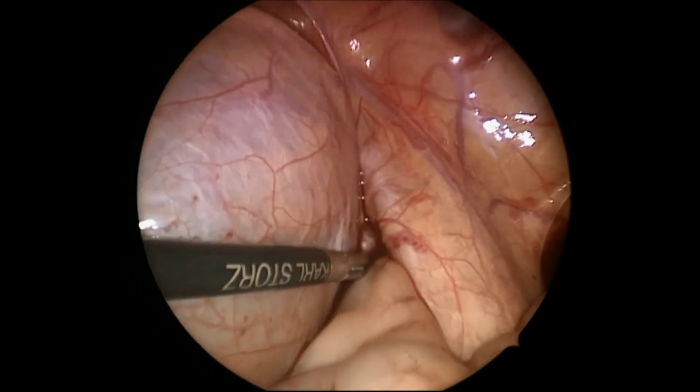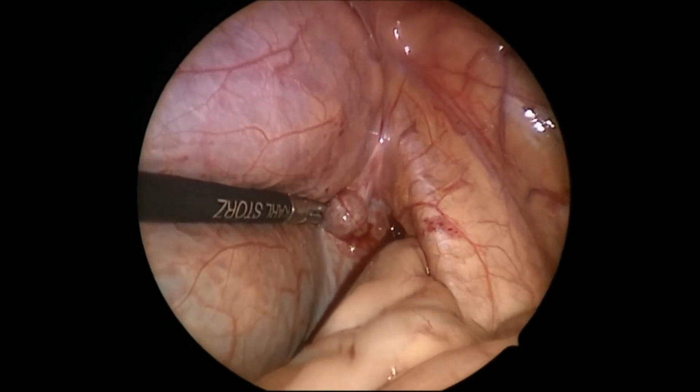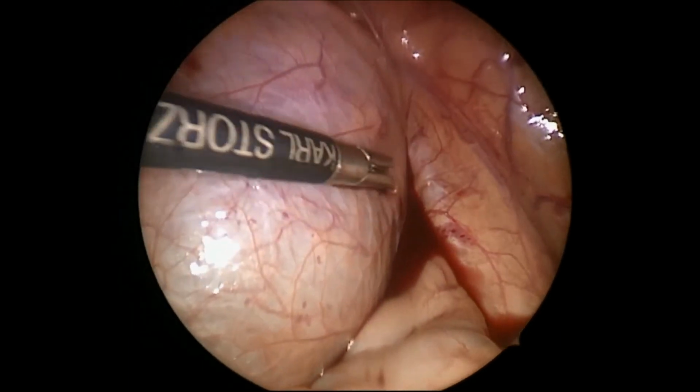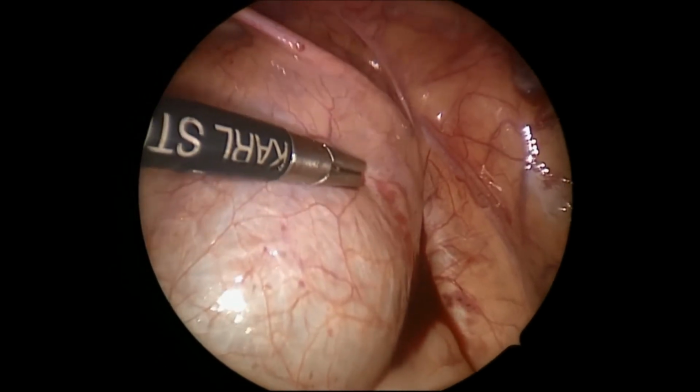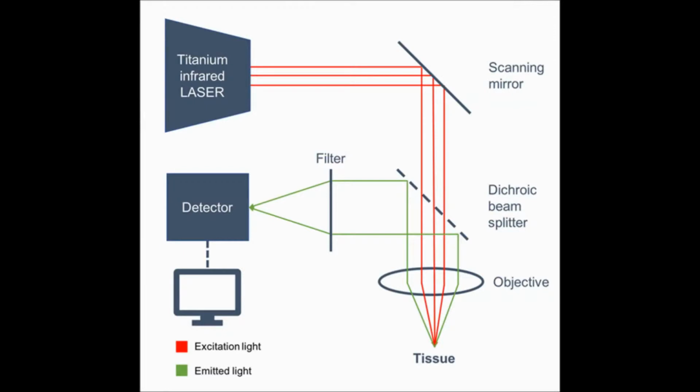The gold standard of frozen section biopsies to determine clear resection borders is stressful for pathologists and time-consuming. Multiphoton microscopy may bridge the gap between surgeon and pathologists in the future, bringing pathologists to the patient's bedside and offering surgeons an instant microscopic characterization of the tissue of concern.